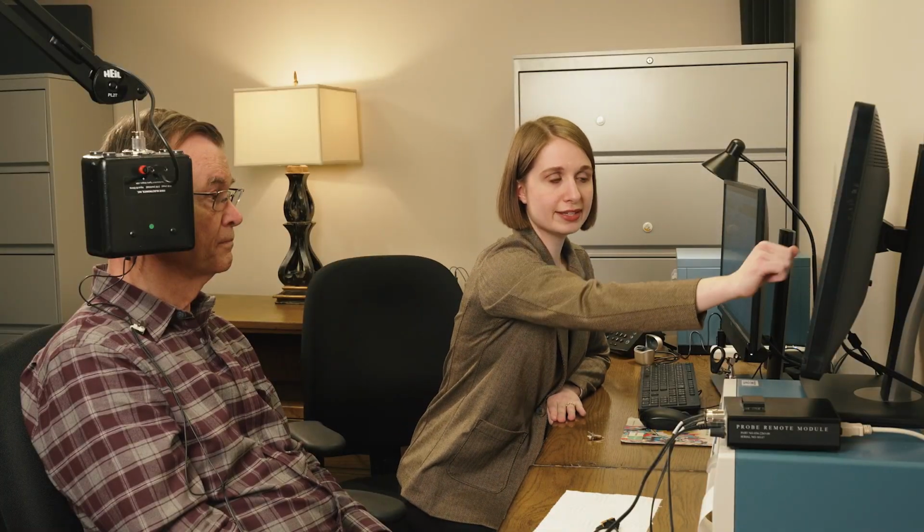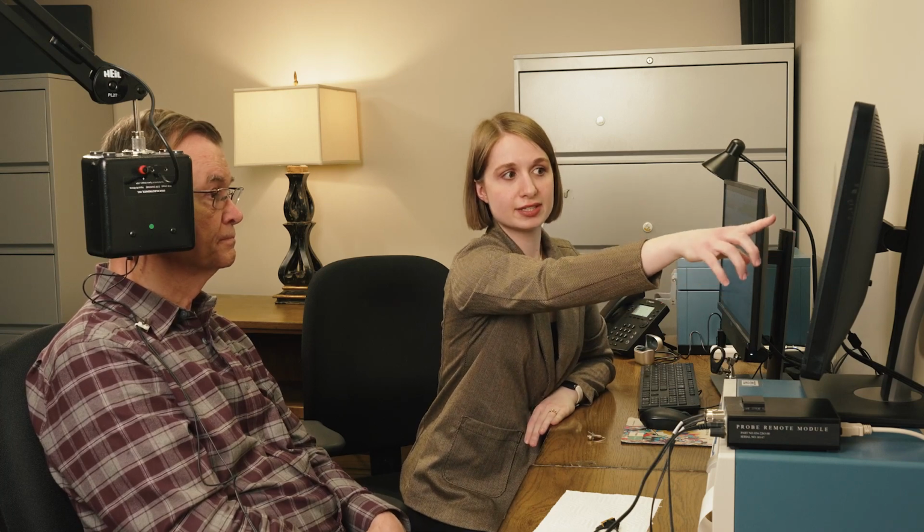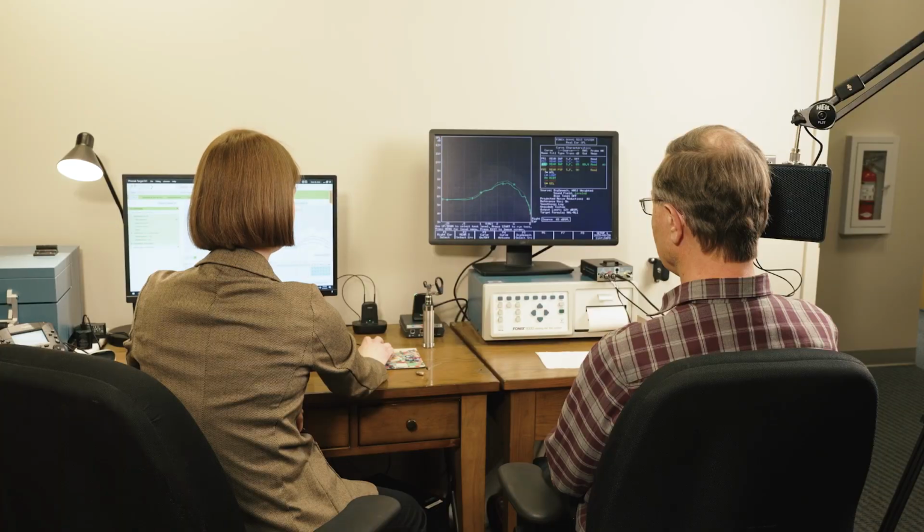Again, this prescriptive target represents what needs to come out of the hearing aid in order to correct the hearing loss. This is very important because different letters of the alphabet are at different frequencies. We want each letter to be the same loudness so that speech doesn't have some letters louder than others. Once we meet the prescriptive target, we have achieved the proper shape.